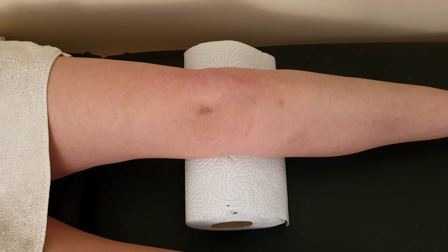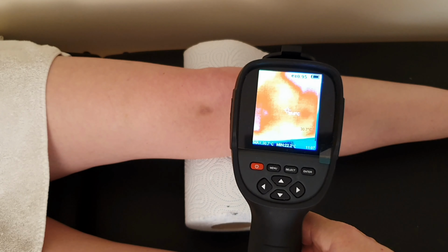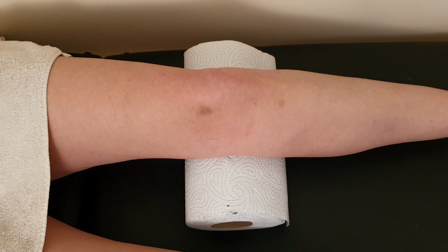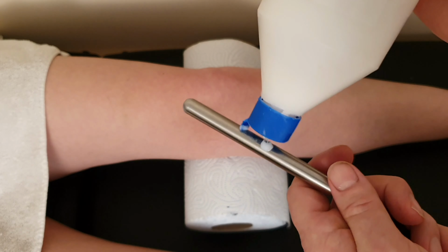Here we are back at the knee. I'll bring the thermal camera in. You probably see there we're about 29 degrees, 28.9 degrees, but 29 degrees on the MCL. I've got the knee slightly flexed, so I've got the knee over a paper roll. You could use anything you want to. This just puts the ligament on a slight stretch. This treatment's much better for chronic ligament problems rather than acute ligament problems.